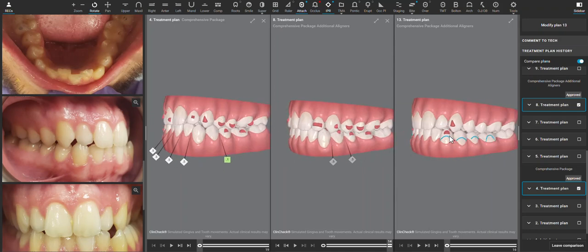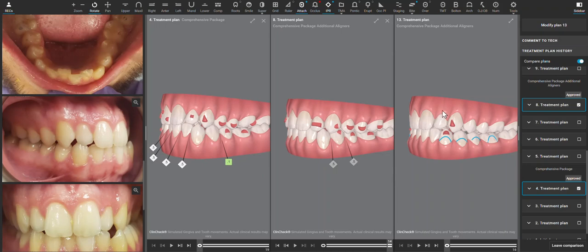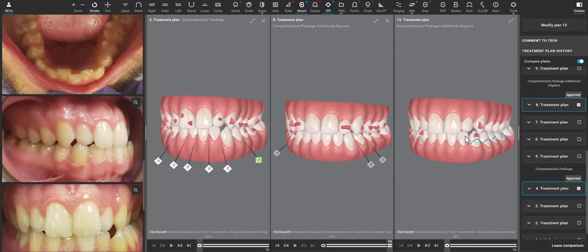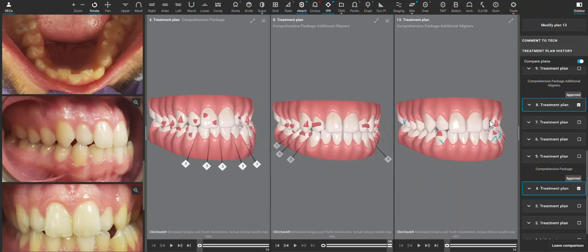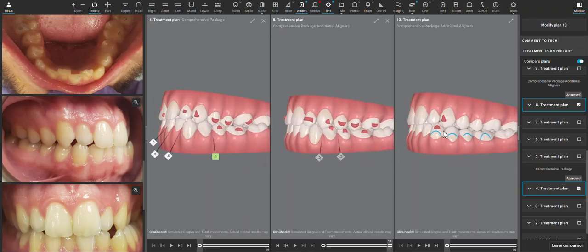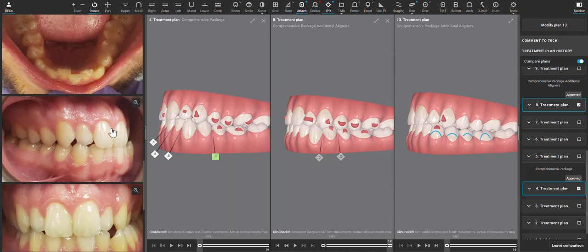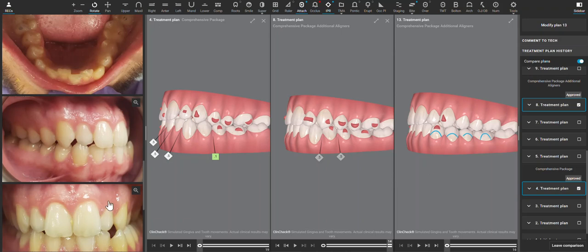And then if that's not enough to get a positive overjet, then we need to leave space distal to the canines. The limitation of how much we can move the upper anterior six forward is going to be how much buccal bone this patient has. I think we have some space to possibly leave space distal to the canines.